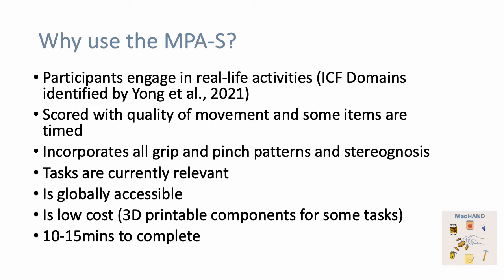Finally, the MPA-S can be assembled with objects that are available anywhere in the world. The instructions are freely accessible, and it is a low-cost test. Some components are even 3D printable to reduce cost. The short form takes only 10 to 15 minutes to administer, which is extremely advantageous in a busy clinical setting.